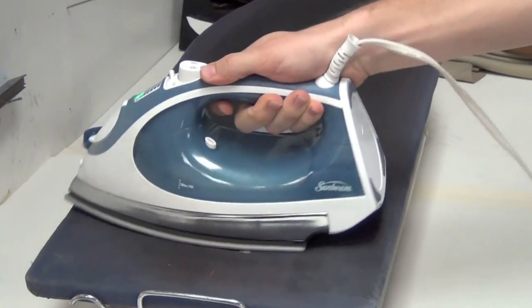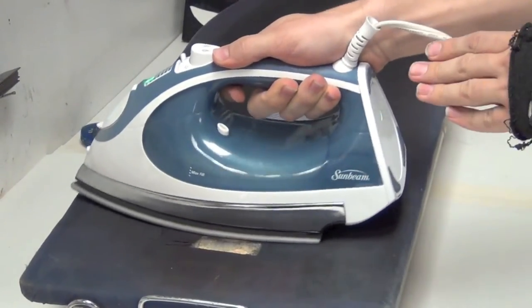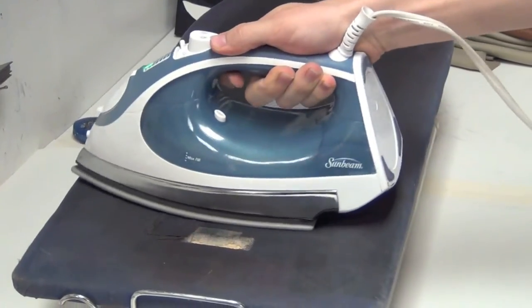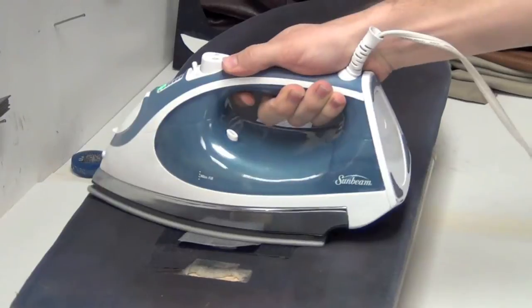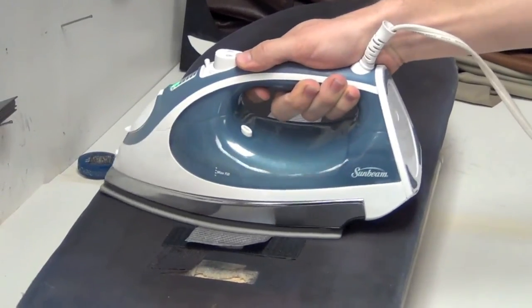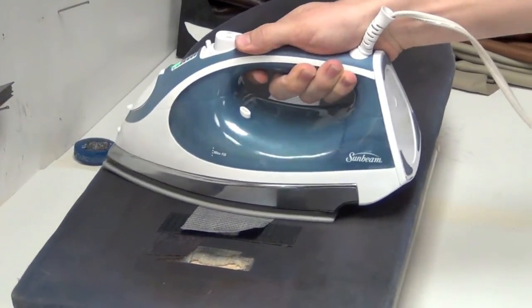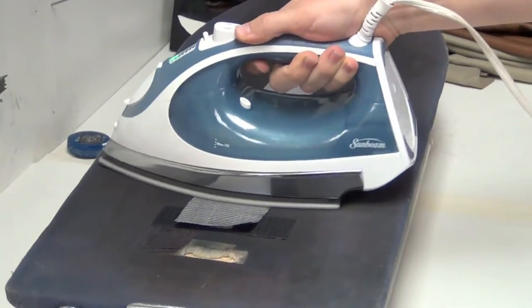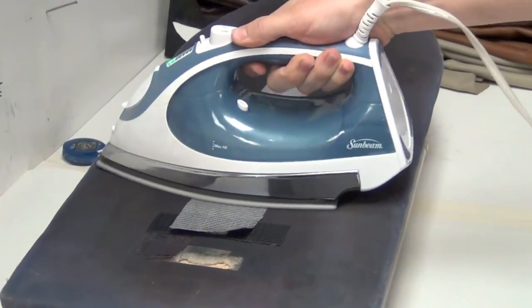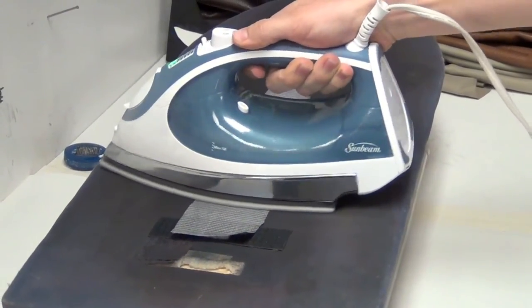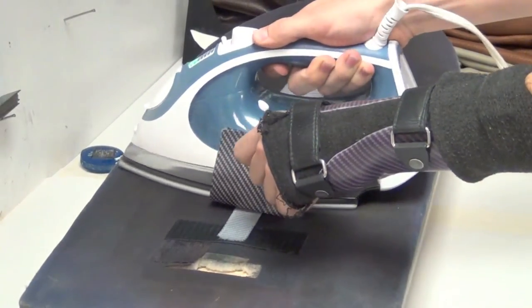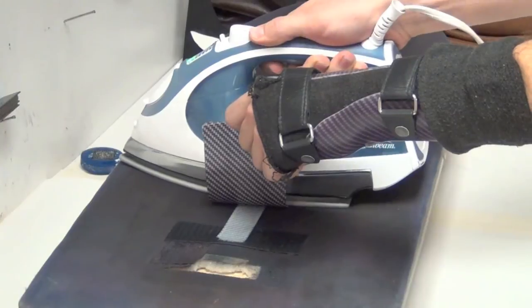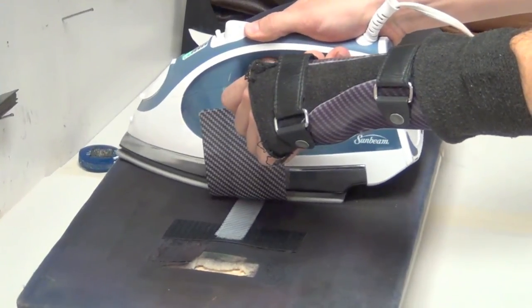Because if you stop moving, then you're going to melt your strap, you're going to melt the paper onto the velcro strap, and you're going to have a bad time. So again, just keep it moving. Just back and forth, up and down, in circles, whatever you want to do. It's going to take you a little while to get to the end, and I might actually be moving too fast. Yeah, I'm moving way too fast.